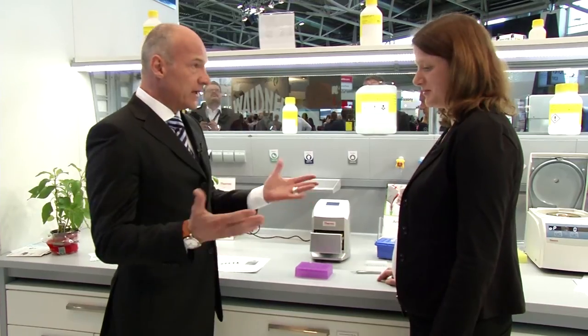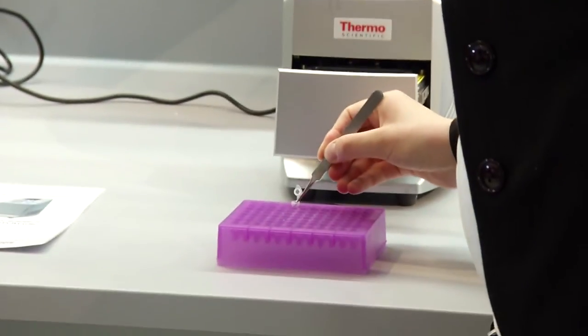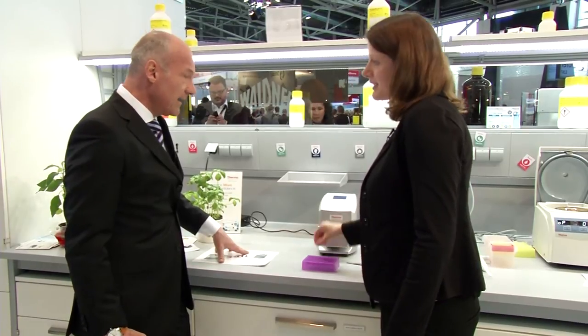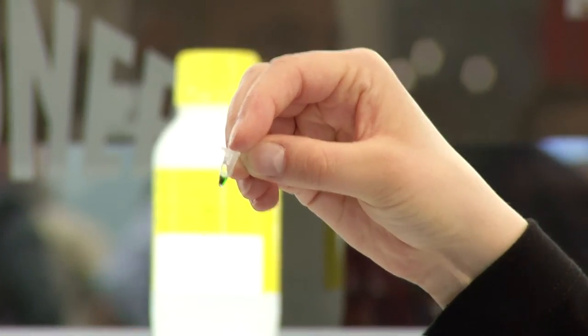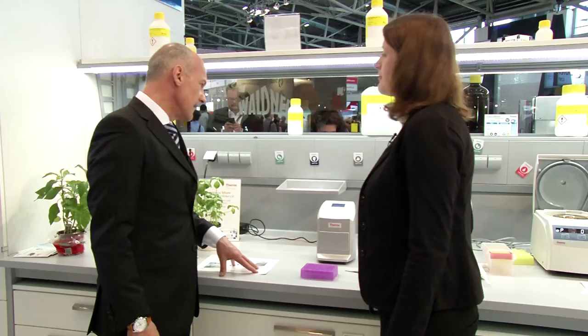We can easily simulate a DNA analysis based on the certified conditions of a forensic laboratory. Tell me what you need. Nail clippings, hairs, you can have them from me. A hair would be good. Help yourself if you can find one. And what happens now? Well, I've put the hair into this little tube and it goes into the device. Turn it on, and then we wait.